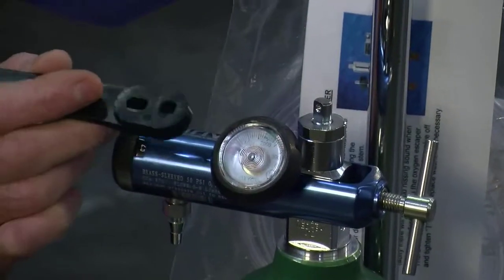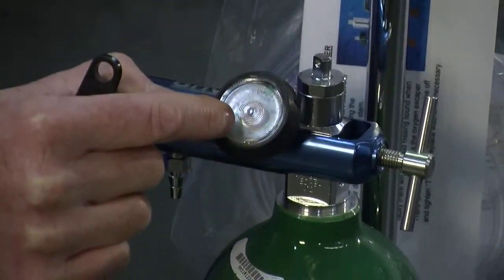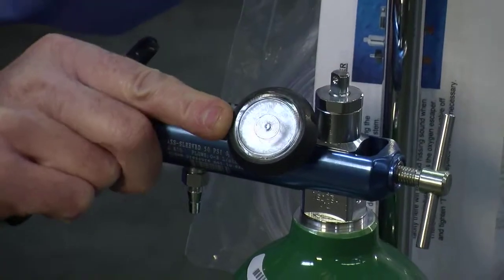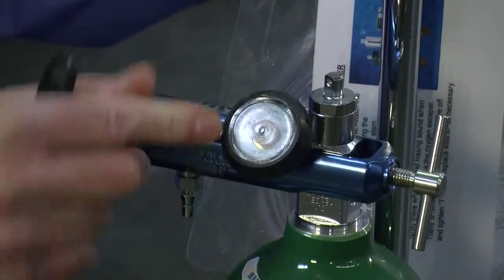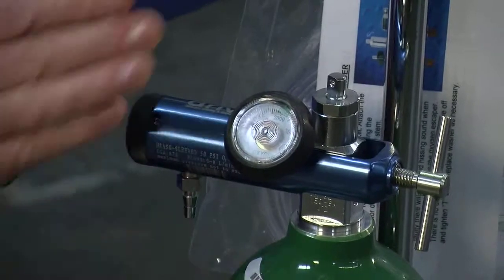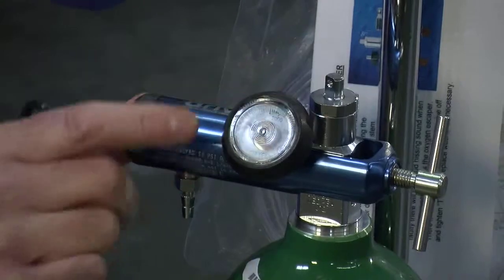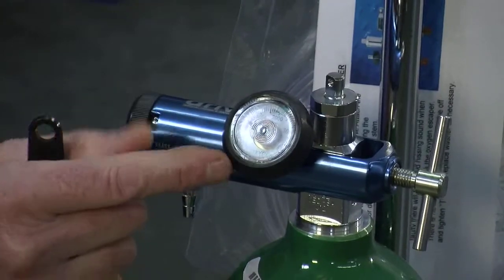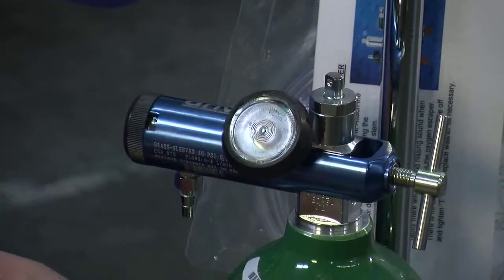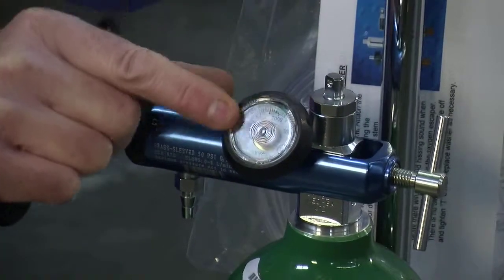Next we have the oxygen regulator which includes a contents gauge showing you basically the cylinder's content. Once you turn it on, it's a gauge that goes from 0 to 2,000 PSI. 2,000 PSI is considered full. As it's being used it's going to be going down towards zero.